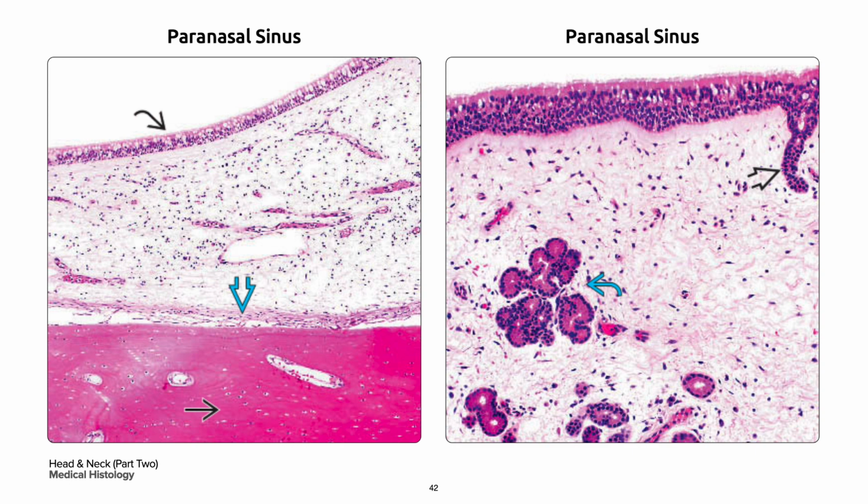On your right, in contrast to nasal mucosa, the seromucous glands in curved blue arrow are less numerous and more randomly distributed. These drain to the surface via small ducts in bold black arrow. Also, the stroma does not contain a prominent vascular component.